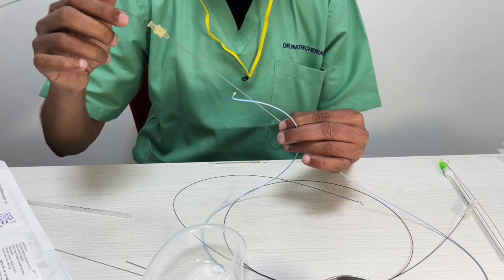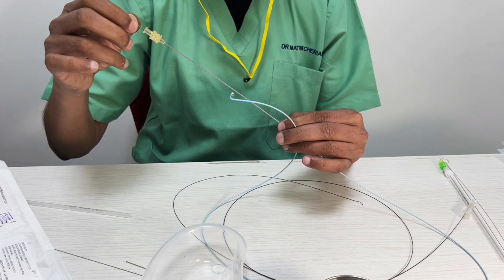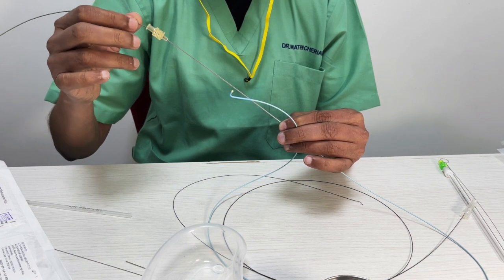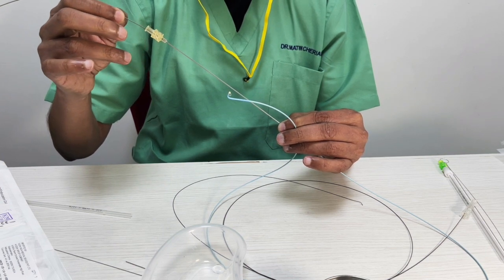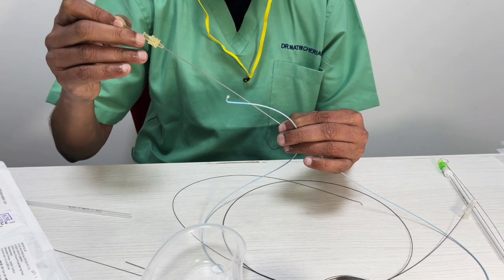And how do you size your coil? The size of the coil should be 1 millimeter more than the diameter of the vessel. So this was a 16 mm coil, so ideally it will work in a 15 mm vessel, right? Those kinds of vessels are not very common. The commonest coils we tend to use are like 6, 7, 8. So as we come out, I'm just coming slow.